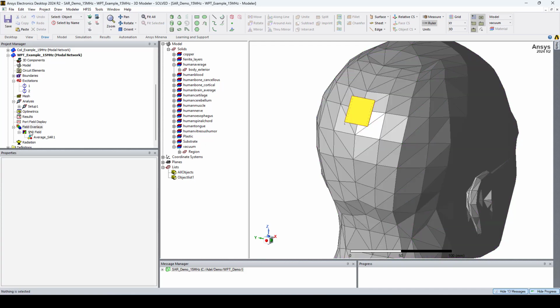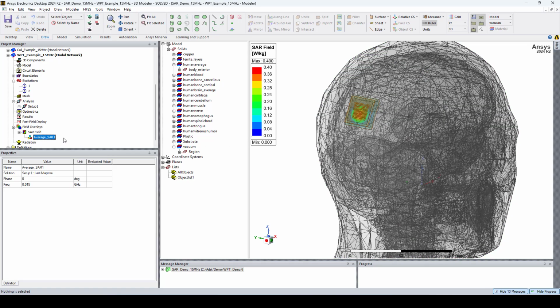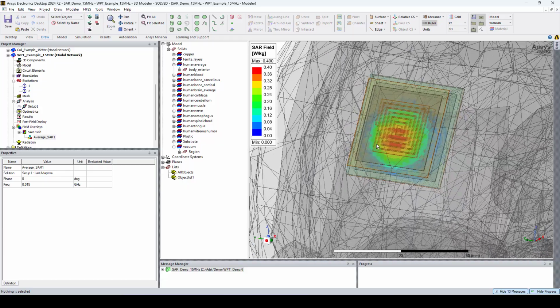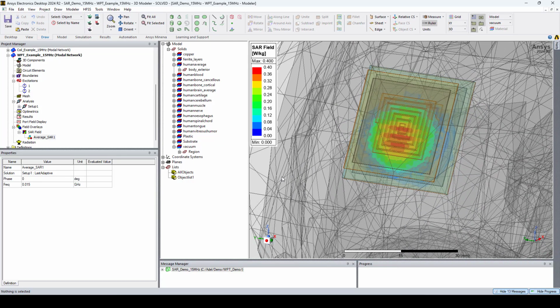Now if I go back to the SAR results and double click on it, you can see our SAR distribution and maximum value. Here with 1 watt of input power and 1 gram of tissue mass, the simulated SAR maximum value is 0.4 watts per kilogram. This corresponds to an input power of 4 watts to achieve the US limit of 1.6 watts per kilogram.